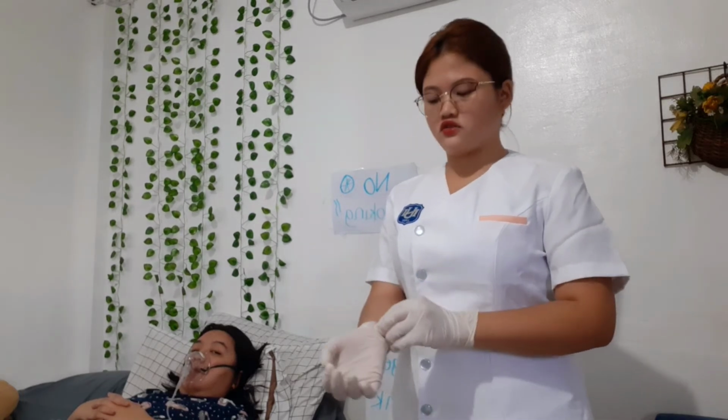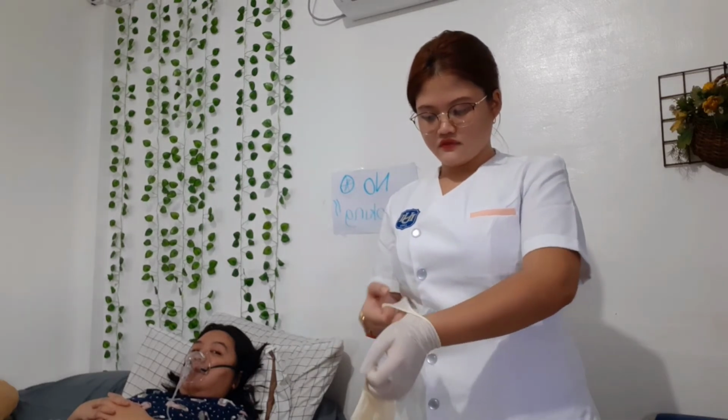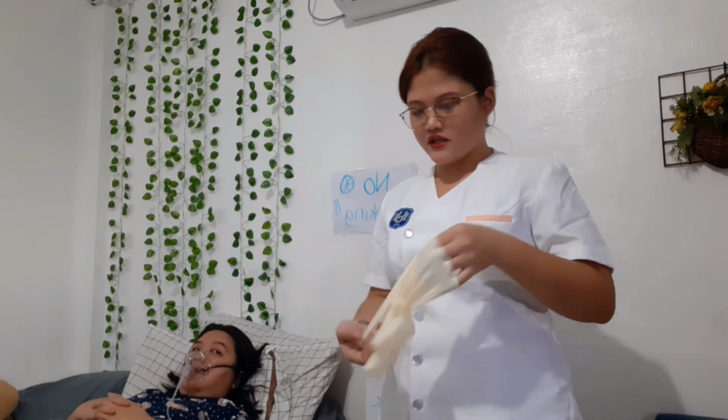Then after that, you need to dispose all waste materials properly to avoid the risk of contamination from microorganisms. Example for this is the gloves. You need to dispose it properly. So last is the evaluation. First thing you need to do when it comes to evaluation is assess the patient's vital signs, level of anxiety, color, ease of respirations, and provide support while the patient adjusts to the device.